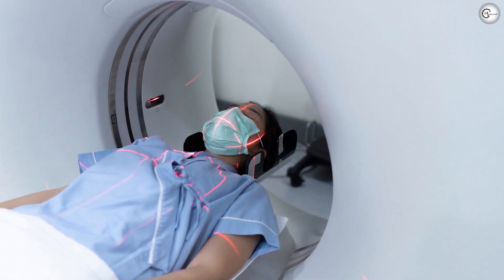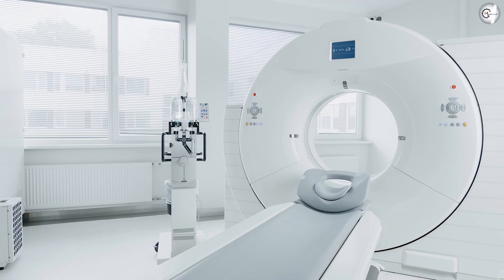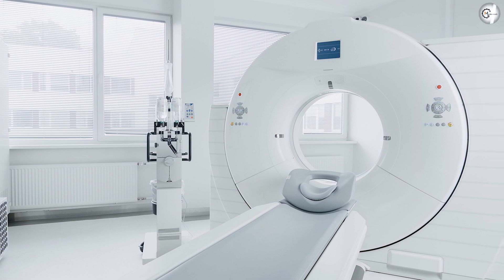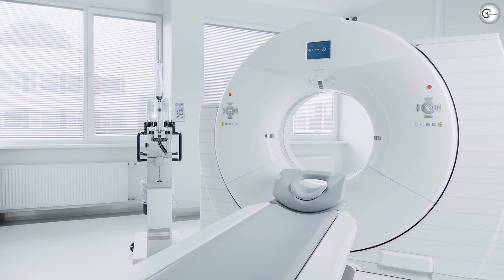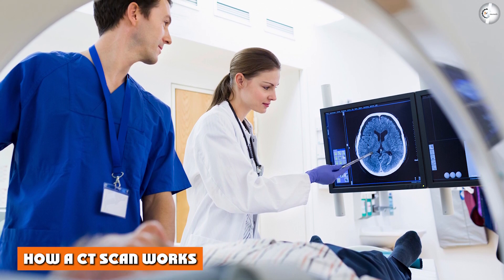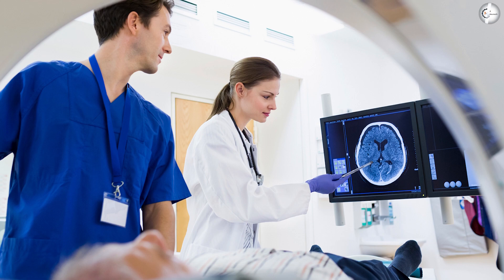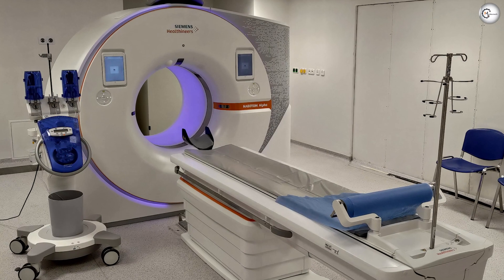Bones are virtually void of water and therefore do not generate any image data, leaving a black area in the images. MRI scanners are best suited for imaging soft tissue.